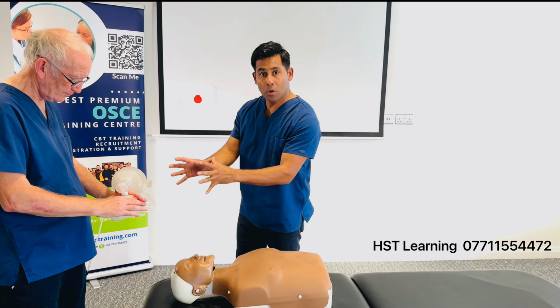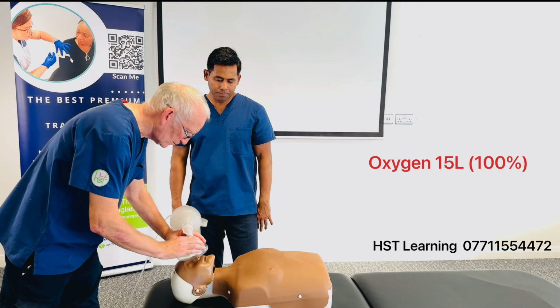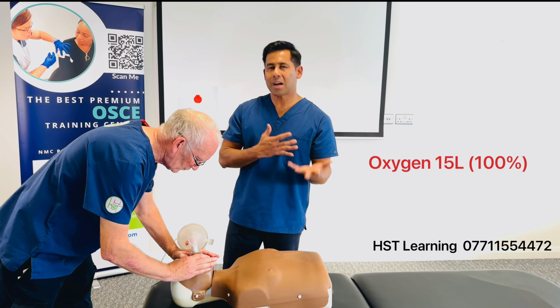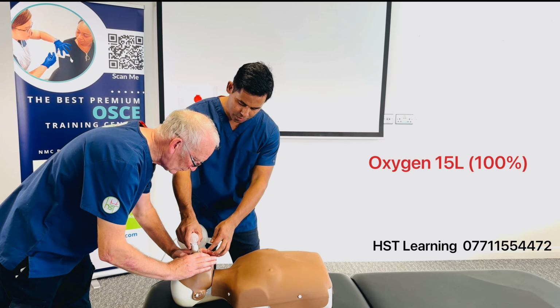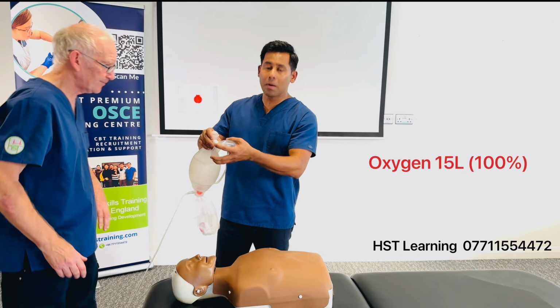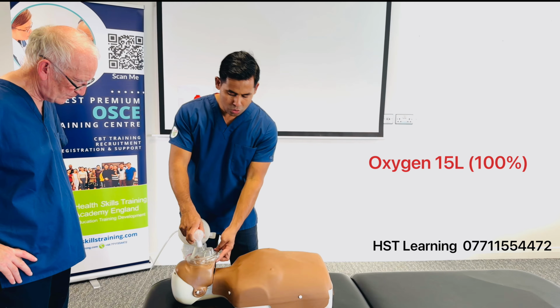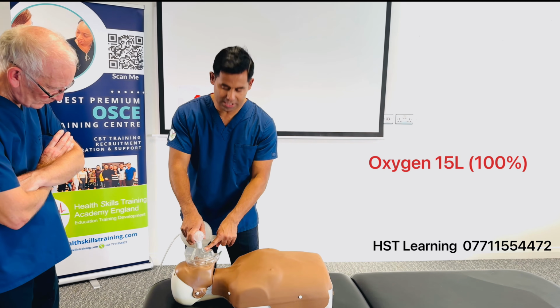The examiner will put the mask on. So let's see how we put the mask on. A common error here is candidates not identifying the mask, how it's been put on. So I'll show you an error here. Can I just have that for a second? Yes. So you might be putting, or the examiner might be holding the mask this way, and two fingers down on the chin. All right, so that is not a good seal.